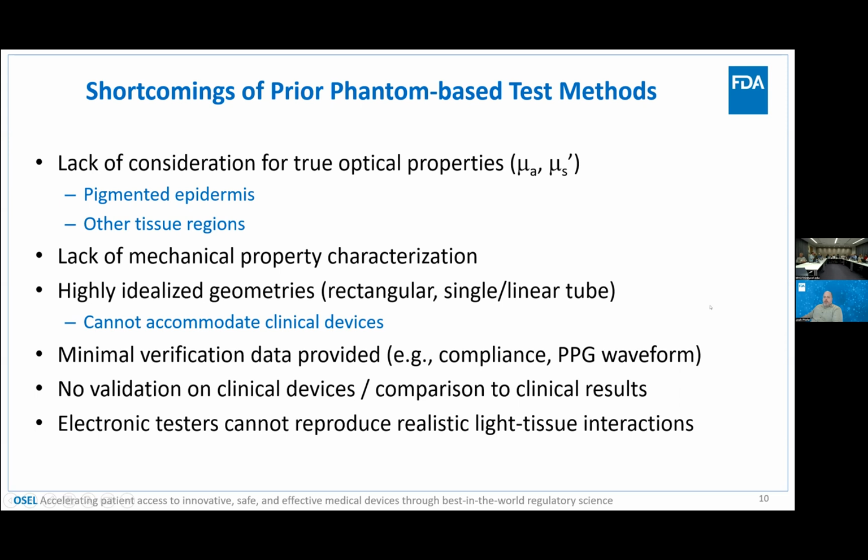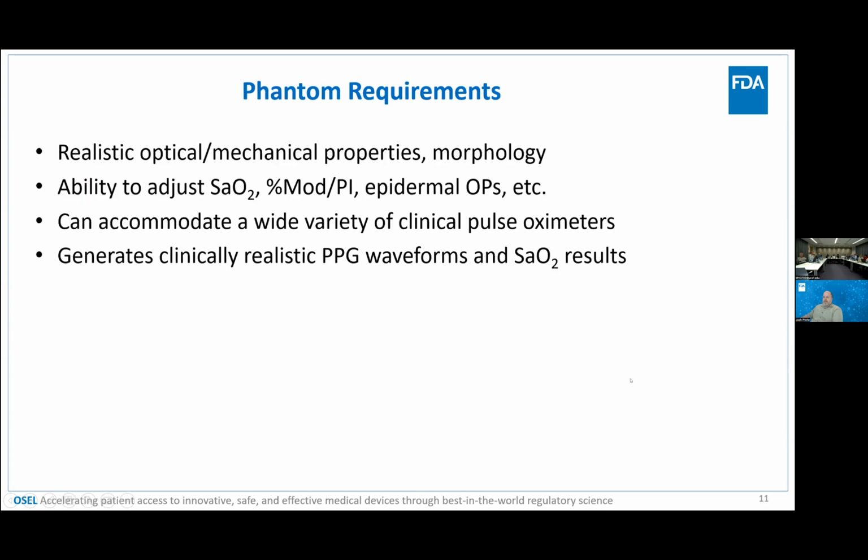The geometries that have been developed typically are highly idealized, and some of them can't even accommodate clinical devices. There's typically minimal verification data provided in terms of the compliance, or ability of channels to expand, and the PPG waveforms that are produced. And there's almost no validation at all against clinical devices in comparison to different clinical results. And of course, we've heard about some of the limitations of electronic testers.